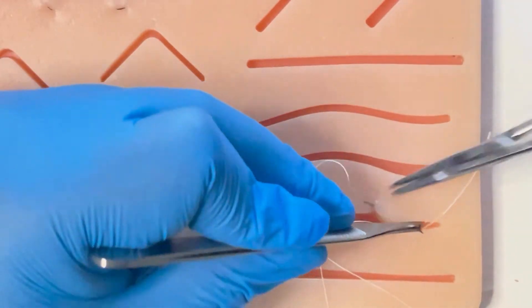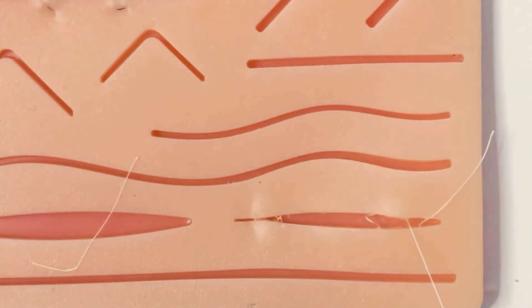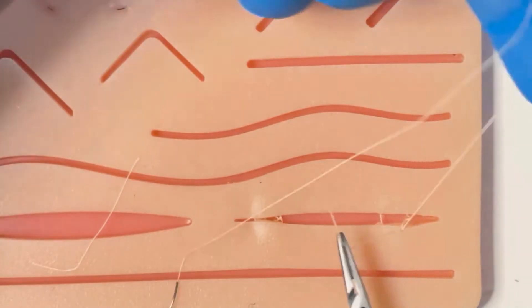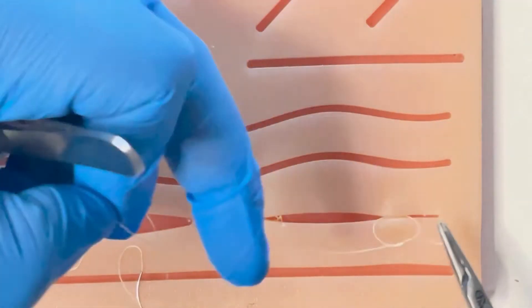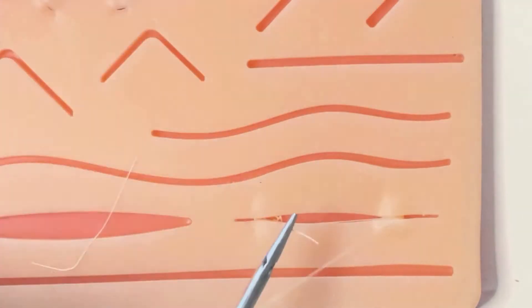At no stage does your needle or suture material come through the epidermis. You tie your knots parallel to the wound. This is a useful stitch for eliminating tension from a wound; you typically use a long-lasting dissolvable suture.